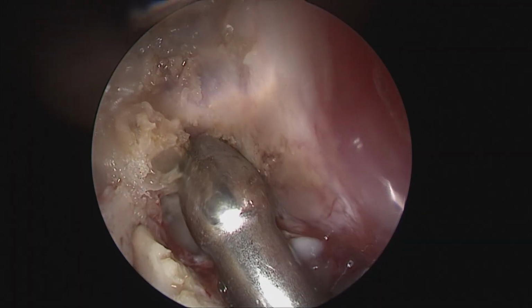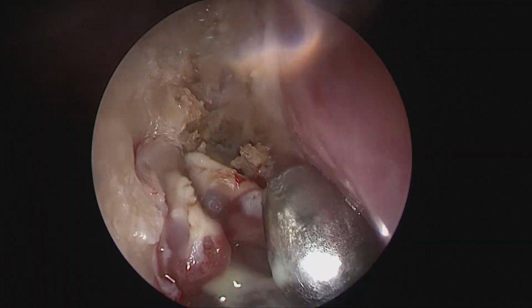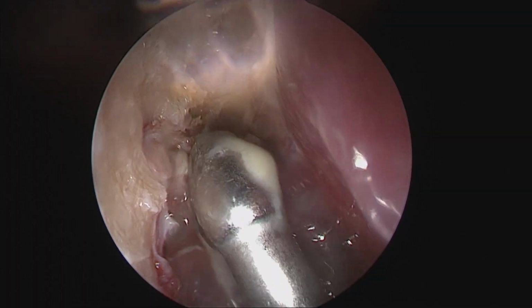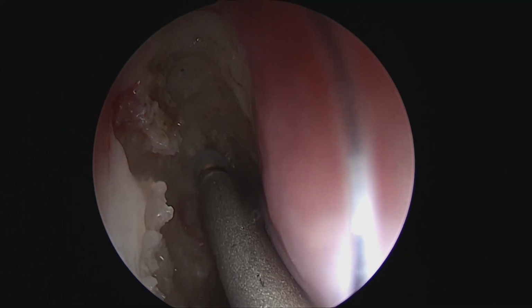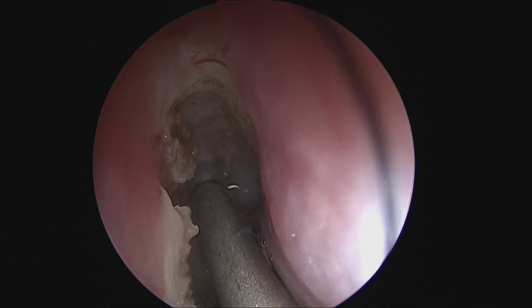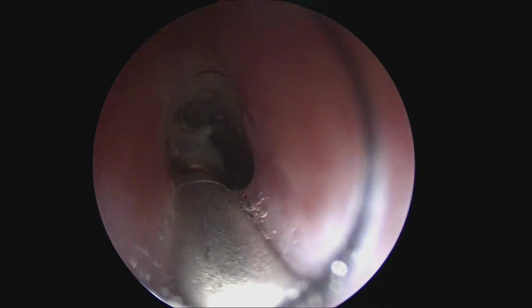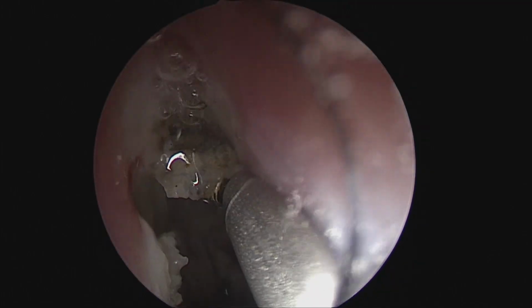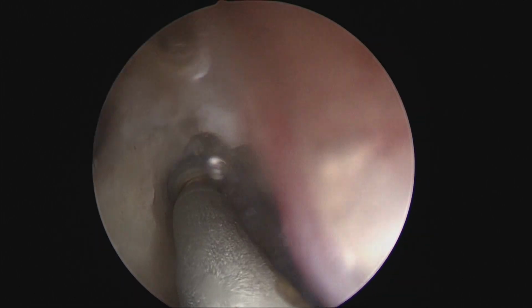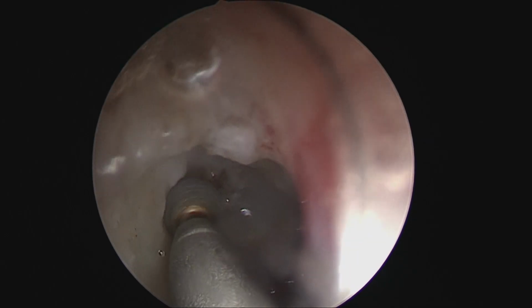We are also trying to identify if we can find the opening of the frontal sinus, to see if that is indeed filled with any fluid or purulent secretions, or whether there is actual tumor inside the rudimentary hypoplastic frontal sinus on this side. Our goal is not to violate the skull base, so we would stop at the approximate location of the olfactory neurons.